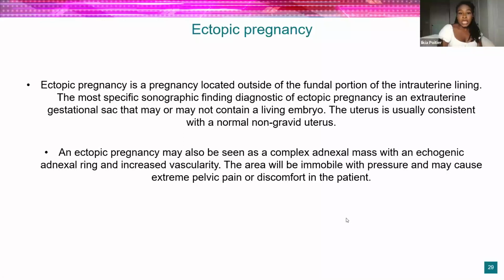So we like to see that. And sometimes if the patient's in a lot of pain, it's very difficult. But for those patients that aren't in pain, we like to push down on the abdomen to see if the area is moving or if it's just staying the same, which is a telltale sign if it's not moving.